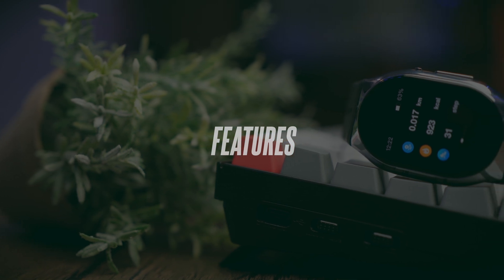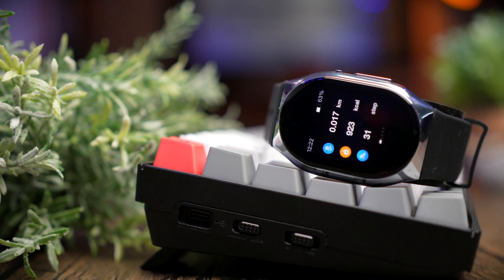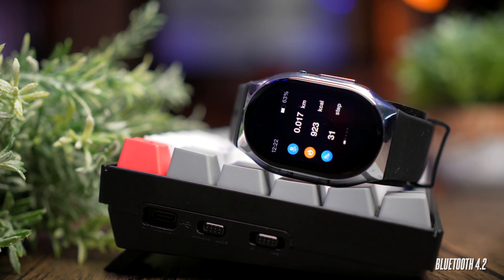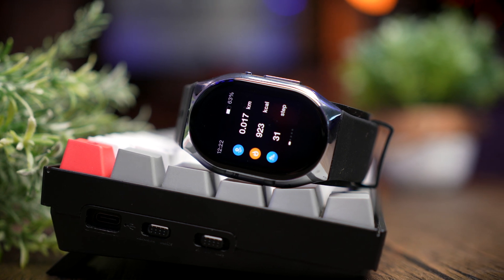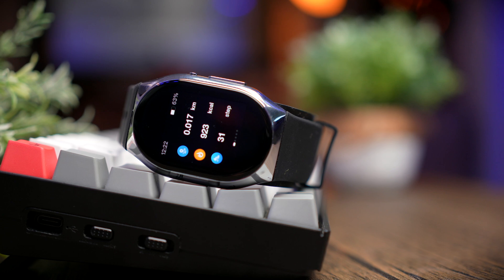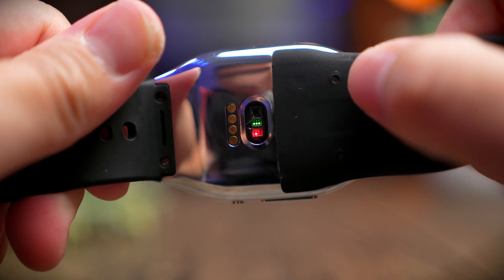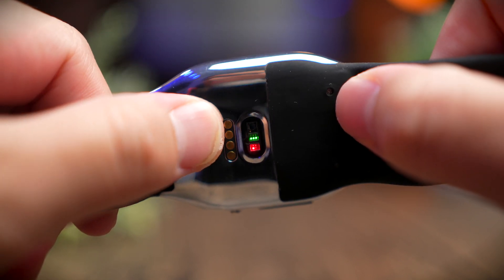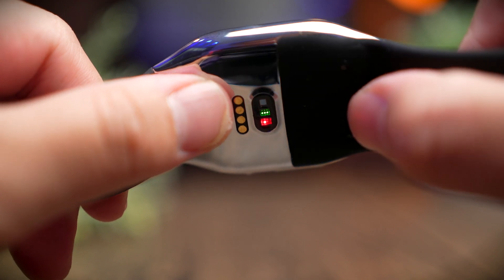We're not going to cover features like a standard smartwatch, since this is clearly not designed for that purpose. The watch uses Bluetooth 4.2, solely for transferring health records from the watch to your phone — it doesn't do anything else with Bluetooth, so there's no need for modern chipsets. It does come with standard smartwatch features such as 24/7 heart rate monitoring, SPO2 monitoring, and sleep tracking.